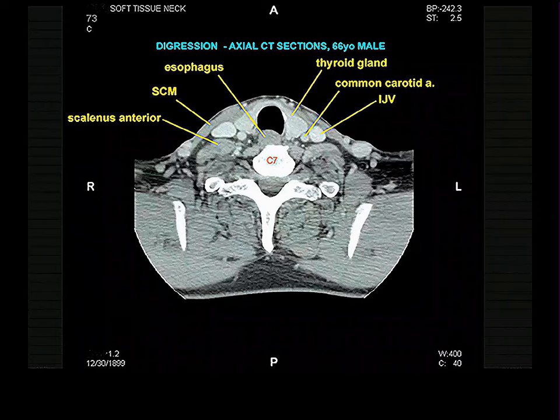So I really shouldn't have to label this. Here's a common carotid, internal jugular on this side, common carotid, internal jugular on that side. Here's a sternocleidomastoid in contact with the internal jugular vein, sternocleidomastoid on this side, thyroid isthmus, thyroid lobes. Here maybe is our vagus nerve. All the other nerves are made up. This is our trachea, very clearly our trachea, because it has that flattened or even concave posterior wall. In this person, the esophagus is directly posterior to the trachea. It doesn't seem to have any extension to the left of it at all, but that's not typical.